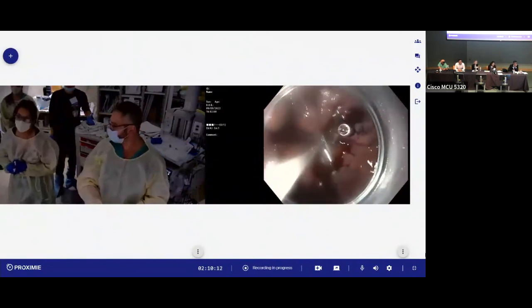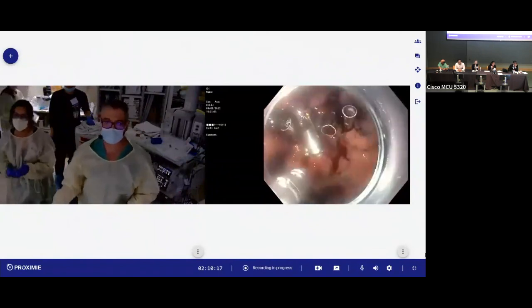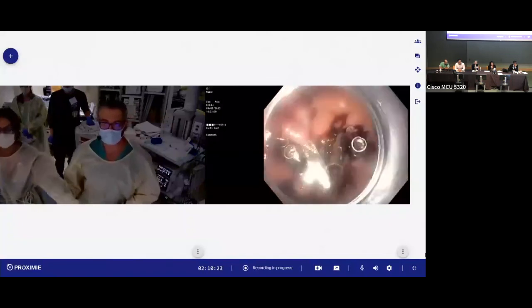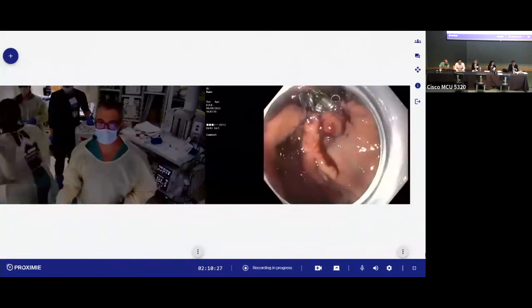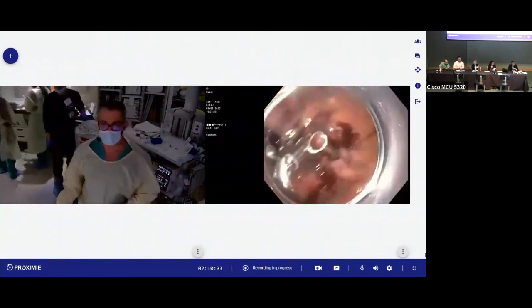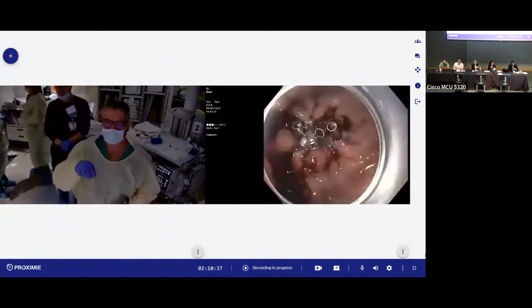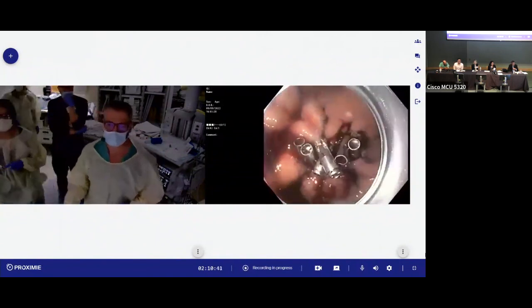Close. Beautiful, deploy. Great job. All right, let's assess if we need more. I think I closed it now, except maybe the area up here that I wanted one clip for on the other side. So let's get one more clip. Mohammed, just when I was about to say that there's no more room to put any more clips, you said you're going to put one more. Just one in between on the right side, between number 1 and number 2 from the right.